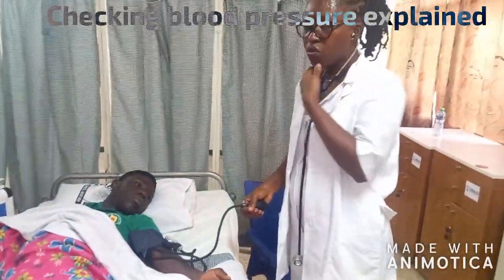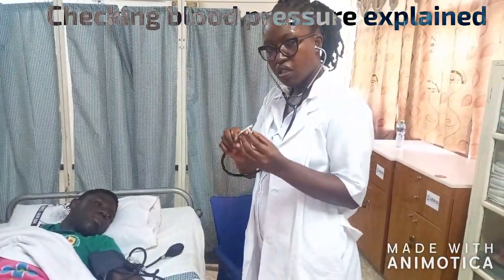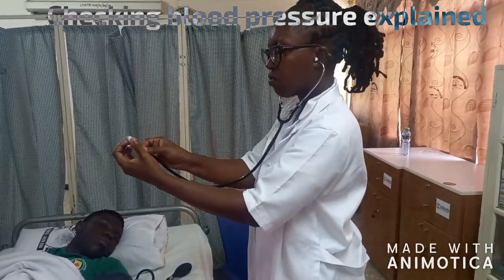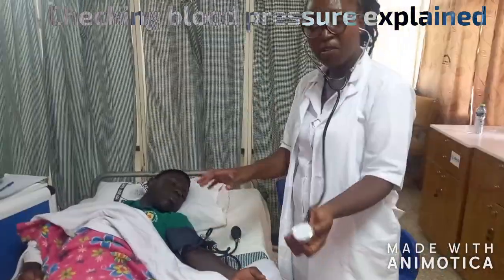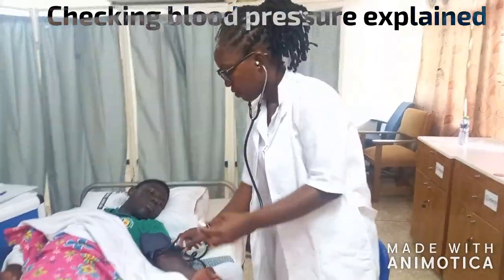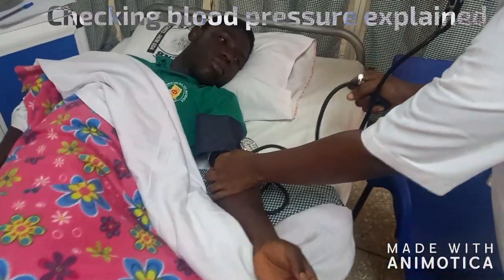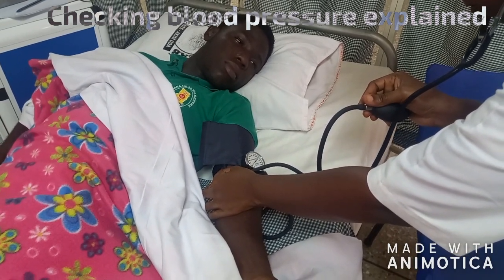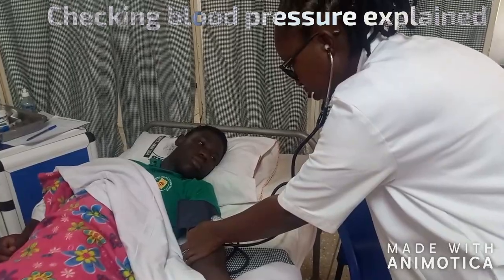You fix your stethoscope in your ears and check if it's open. If it's not open, you turn it — turn this way to open and close. Now we are going to put the diaphragm here on this side of the antecubital fossa. And we will deflate gently, slowly. You deflate whilst listening to the beat. You note where the first beat will be and where the last beat will be.